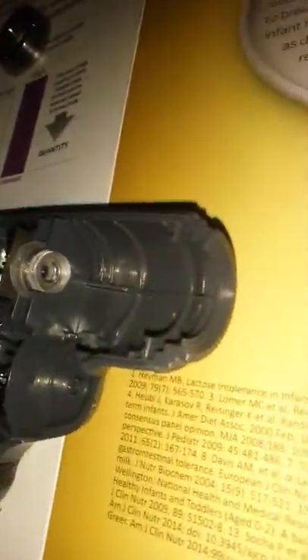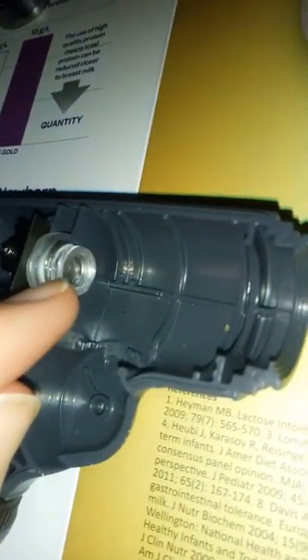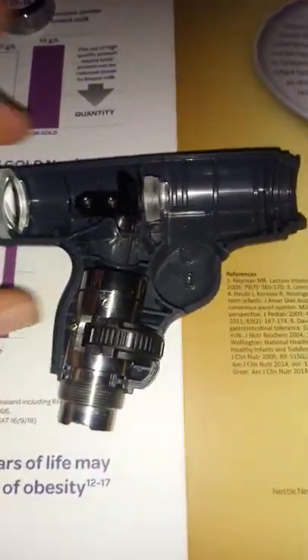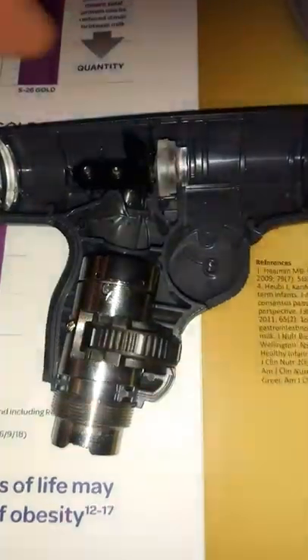Now, the issue with this was that this little lens here had fallen out. It's just held in place just by being tight, and it came loose and fell apart. Welch Allyn said it was going to cost $300 to service it, and we opted to just buy a new one. Then this sat on the shelf for a year and I've decided to disassemble it.